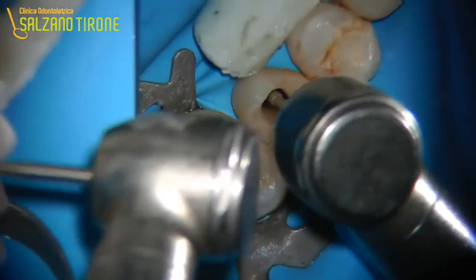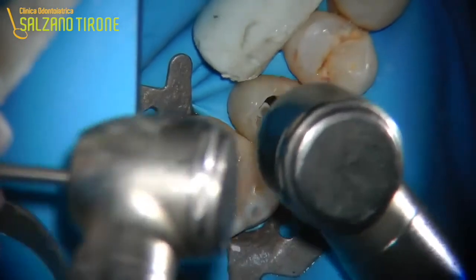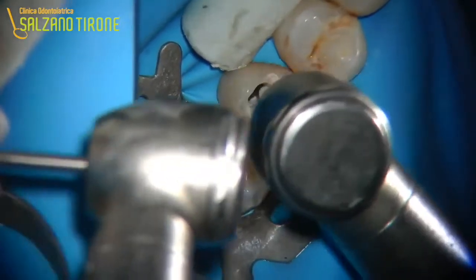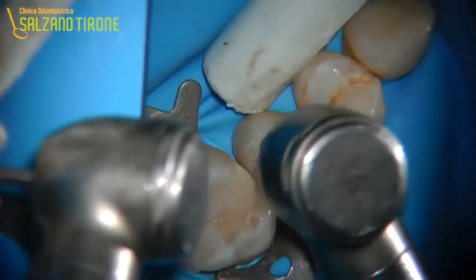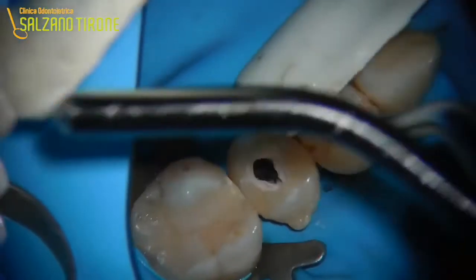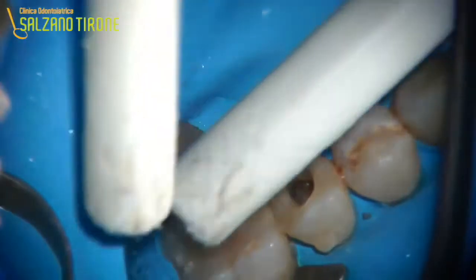Then we peel on our way out as if we were making an opening access for an incisor to take out the undercut below the cingulum. And this can be done with diamond ball bars on a turbine, or, as we can see now, even with a rose bar for contrangle, which work a little more slowly and can help remove the granulation tissue, understanding where the dental tissue starts regaining its consistency.